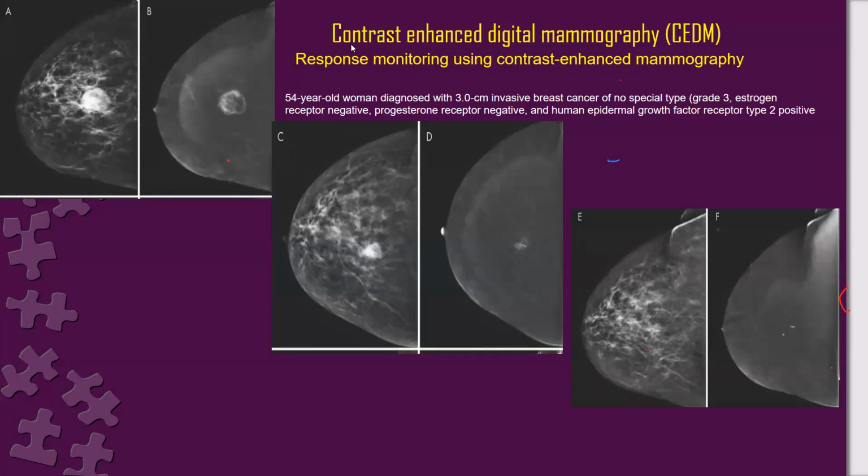Large enhancing mass at the right breast, decreased in the second follow-up contrast mammogram, and faded away at the site of the clips. Excellent. Well done. Excellent.